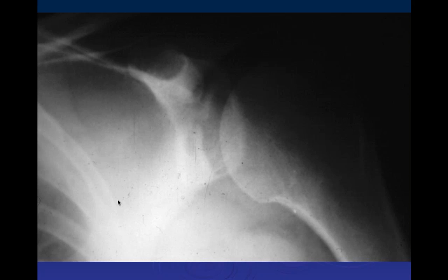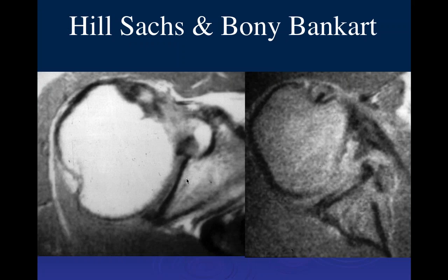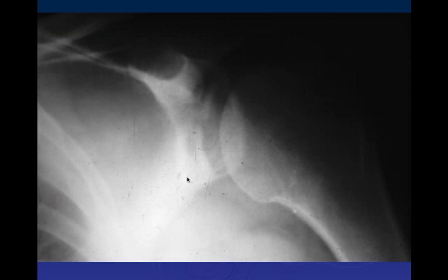Deshali, what do you think of this one? You see the frontal radiograph, the left shoulder, and there's this osseous density that's anterior to the glenoid. Some density here. So what do you think that is? The increased density anterior to the glenoid could be sclerosis related to an old fracture. I can't see the humeral head very well. I would think of it as a fracture, first of all, wouldn't you? You certainly want to rule it out.